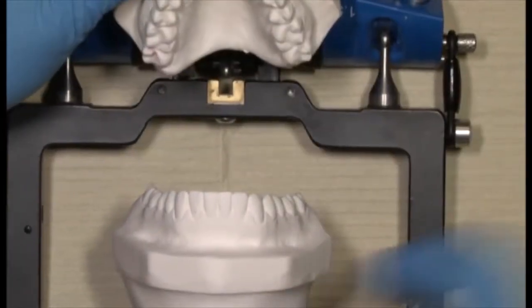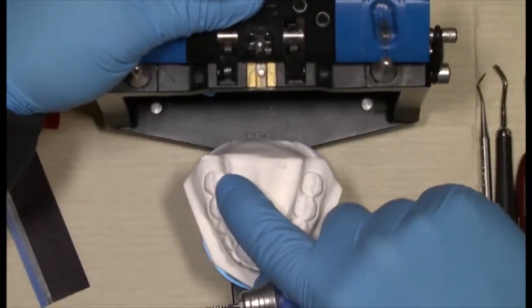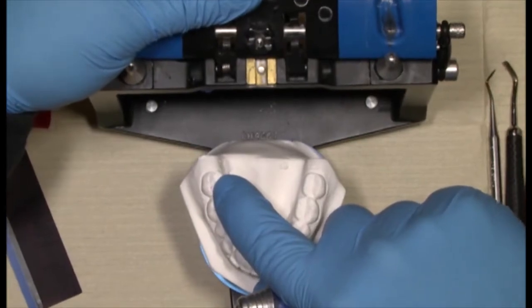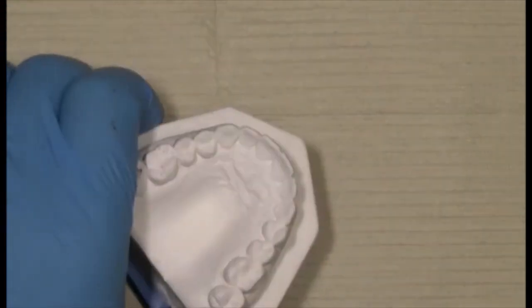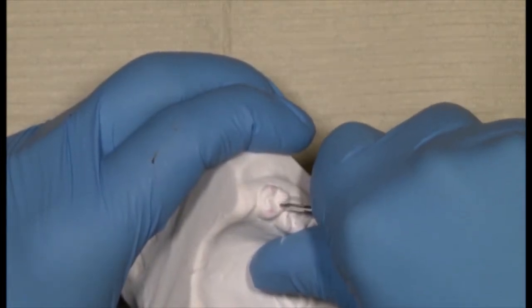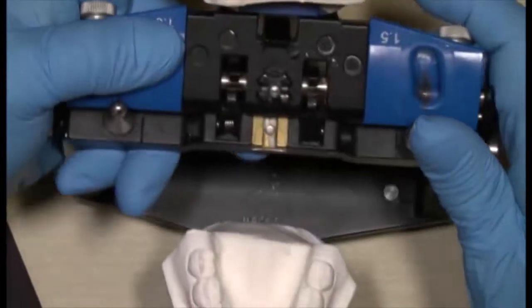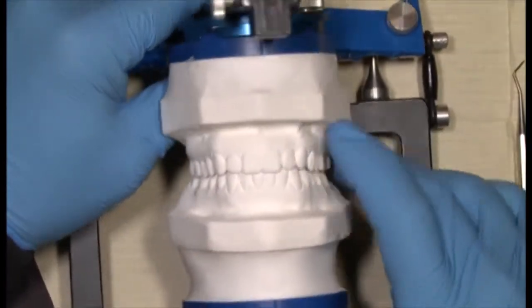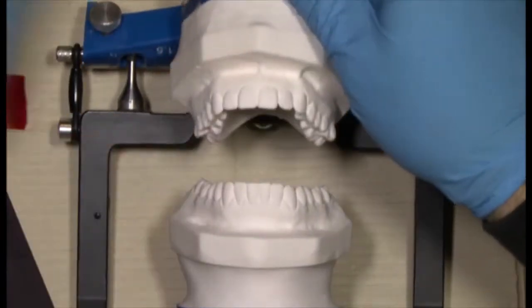Let's begin. When you have an initial point of contact, the idea would be not to touch the cusp tip. It would be to deepen the fossa. As you remember, what we are trying to do is focus on building a home. So by deepening the fossa, you can start to be able to empower the brain. And so all I'm trying to do is not worry about blueprinting the entire procedure. I just want to see if I can gain access to what the end point is.